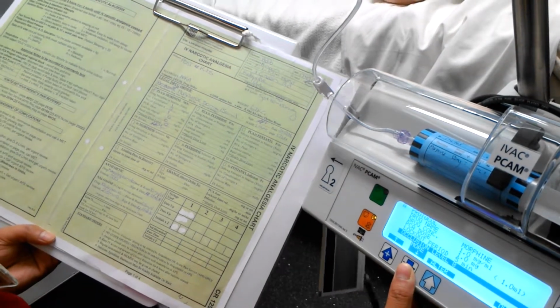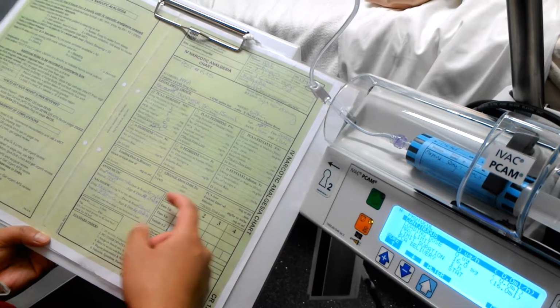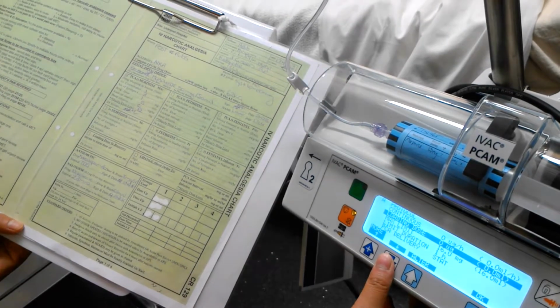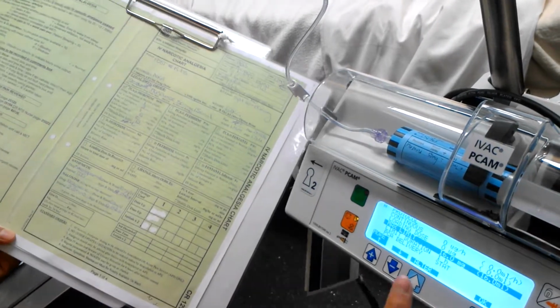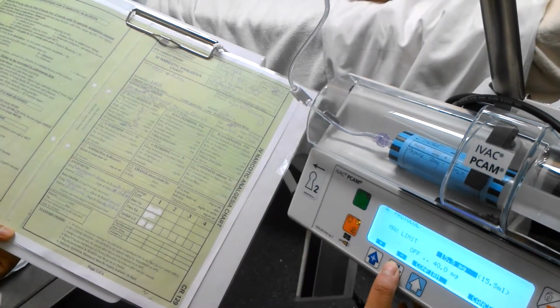Occlusion level, I keep it as 8. Continuous, this is not continuous, so it's going to be kept at 0. Loading dose is 0. Maximum limit, I can only give 12 milligrams as noted here per mil, so I need to change this one to 12. So I've done it.